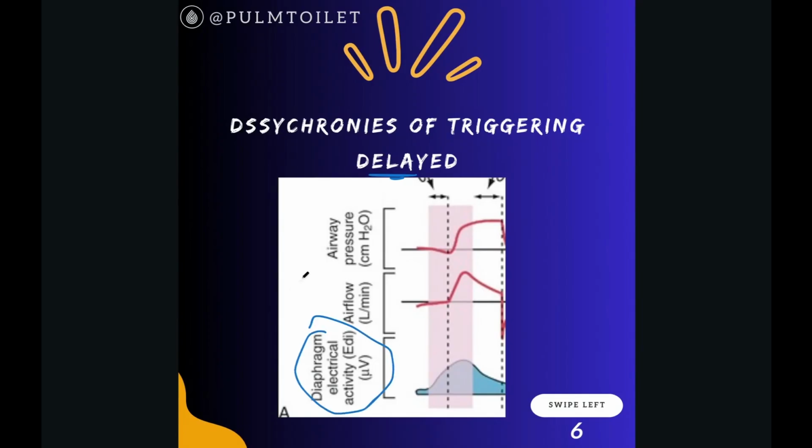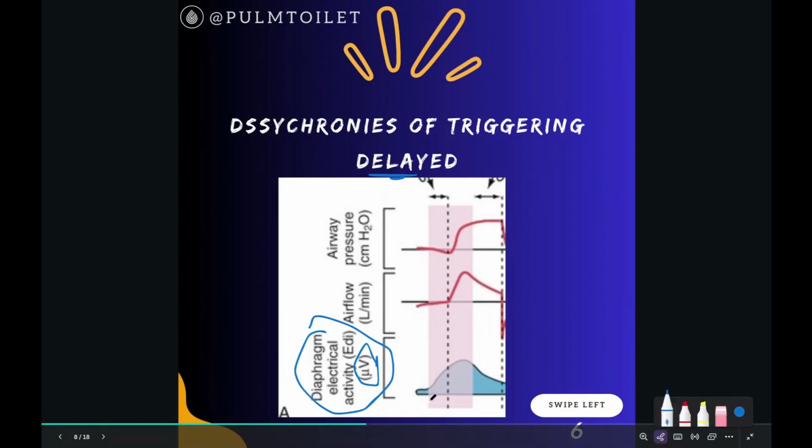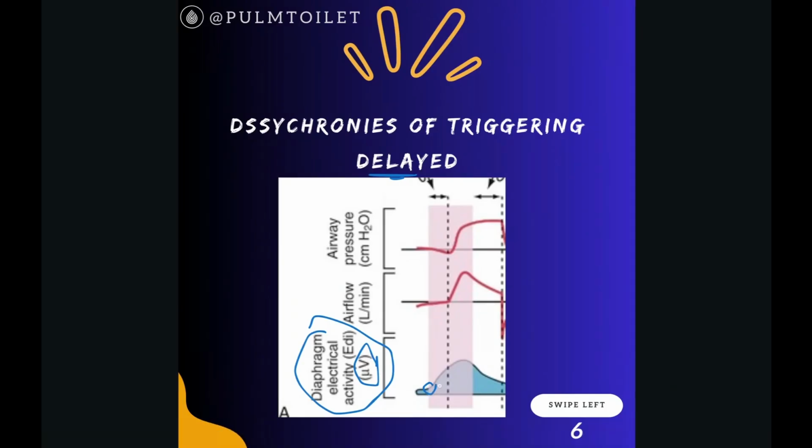So if we had a NAVA catheter, so NAVA is this specialized catheter that can sense the electrical activity of the diaphragm that you can also have the ventilator set to, and that's NAVA, which is a whole separate issue. But essentially what NAVA is sensing is diaphragmatic activity. So a perfect ventilator, once the diaphragm is active, it would fire. The vent would turn on because the vent would know that the patient wants a breath.